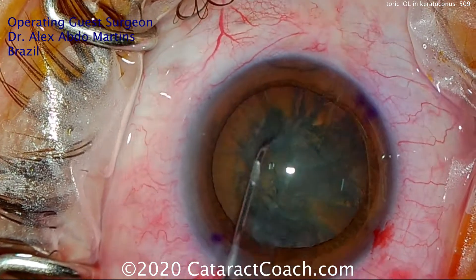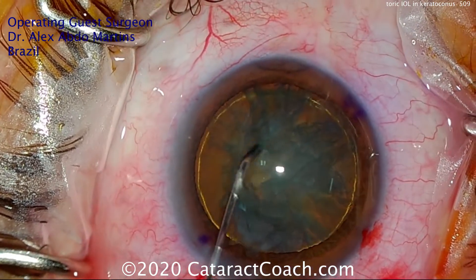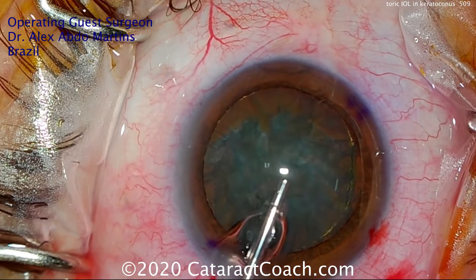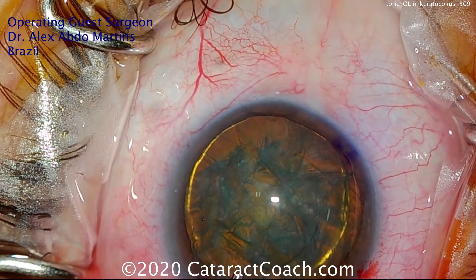The lens has been loosened up here, and Dr. Martins is going to do a nice phaco-chop technique. The best approach is to look at the central 3mm optical zone — make sure that's the most important zone, and make sure the patient has a regular degree of astigmatism there.